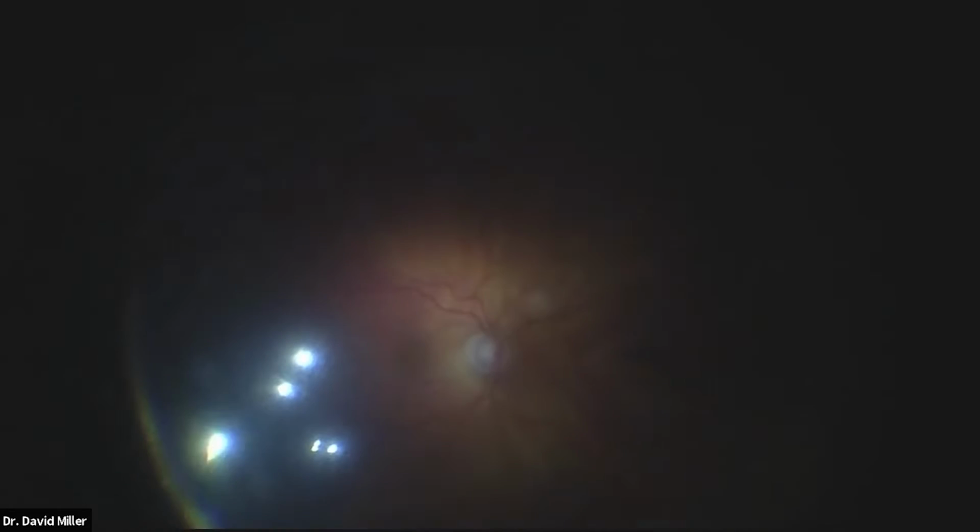And you can see the retina flatten right back down from that little bit of reaccumulation. I'm a little concerned maybe that the retinotomy site's a little not treated on the posterior edge. Can you have the laser back there, Kim? It's still on, right? So I'm just going to treat the posterior edge there a little better. And not have to worry about it. There you go. Very good. So we're nicely attached. Retinotomy is lasered, some laser down below at the lattice, some laser over at the tear site temporally and superior temporally.